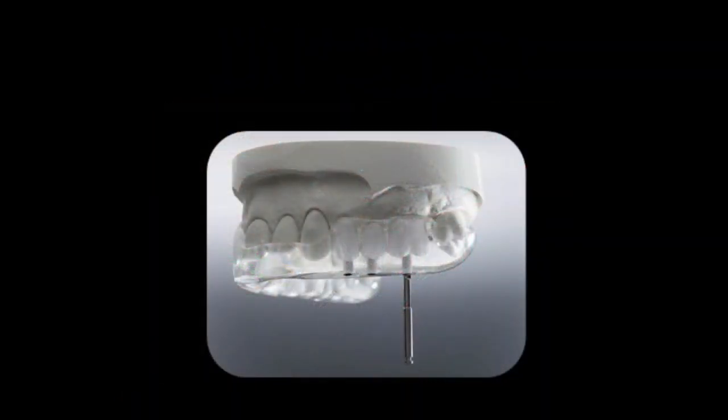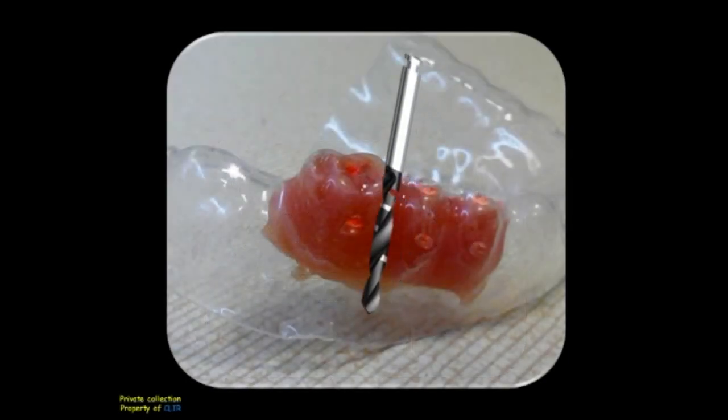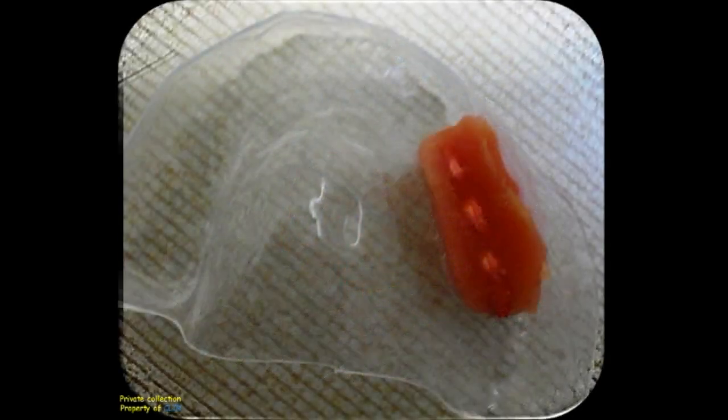Sometimes, when we are dealing with a small patient's mouth opening and posterior teeth, we'll have a problem whenever we are trying to insert our burr into the tunnel. This is why we are drilling a tunnel buccally until we touch the occlusal and the crestal points. Another view where we can see the direction of the tunnel buccally until we touch the occlusal and the crestal points.